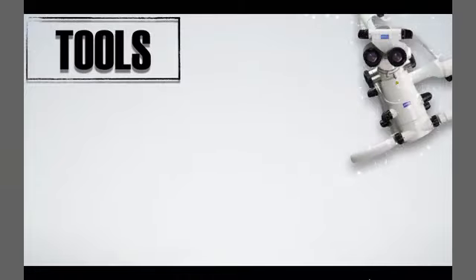We need some tools to manage such situations, and the most important one, in my opinion, is magnification and the microscope. With the microscope, we can see better and differentiate between the calcified tissues and the pulp floor, as we will see later.